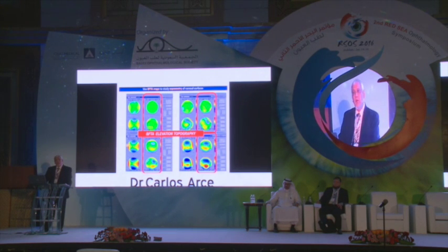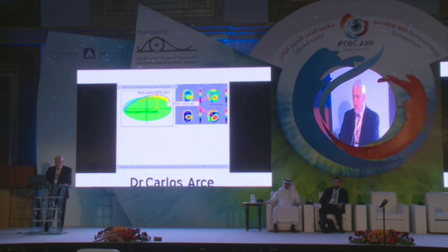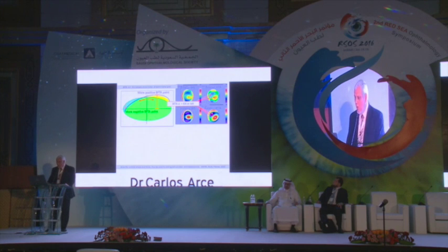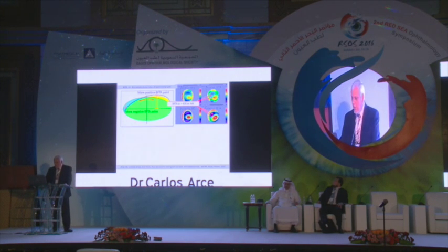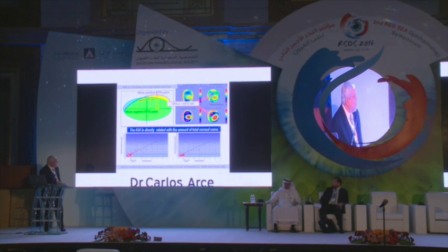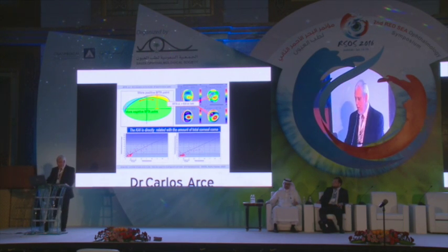The best fit toric-aspheric elevation maps, on the other hand, have to be used to study the asymmetry of the corneal surfaces. And what we are going to see is the delta between the minimum and the maximum point, not the maximum value only. As we showed in Paris in 2010 already, this number is directly related with the total corneal coma.